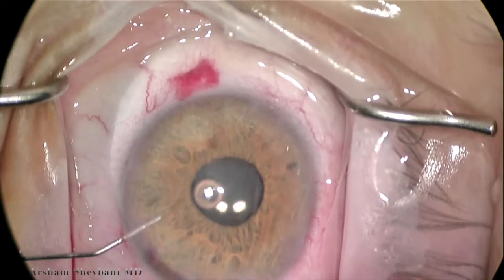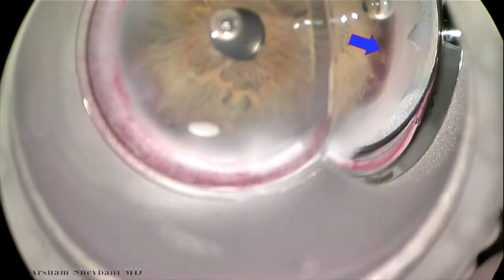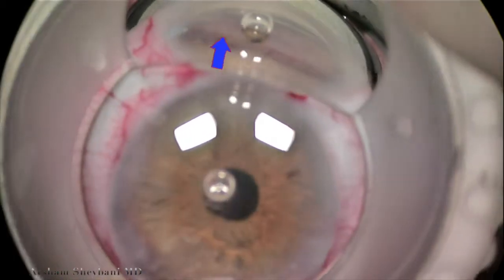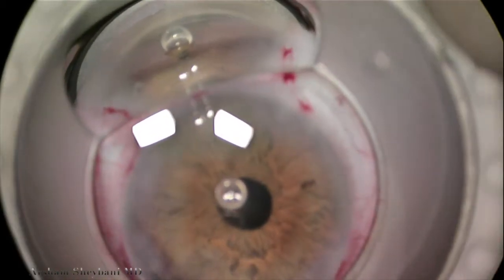When we view the angle with the single mirror, we can see that the trabecular meshwork is now visible. The parts in which we had been working are now open. This patient actually did quite well after phacoemulsification with goniosynechialysis.